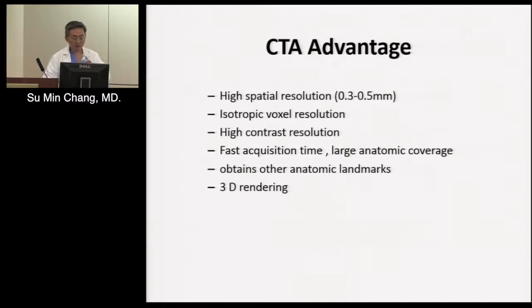The next point is speed. There's no question about it. It's truly amazing that with CT you can image the heart in such a short period of time that oftentimes you don't even need a breath hold anymore. That's very important, especially for inpatients, who sometimes have a hard time lying flat and holding their breath. With the newer scanners, the fast acquisition time is very powerful.